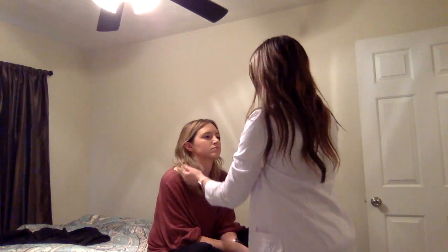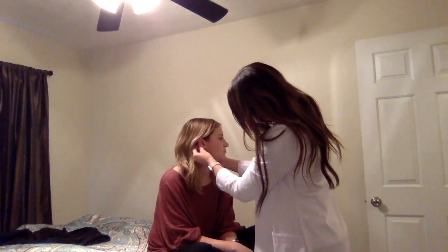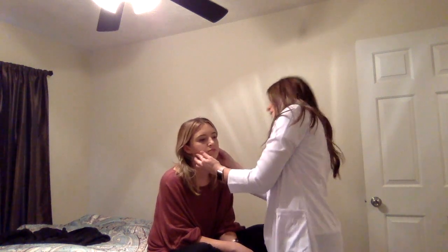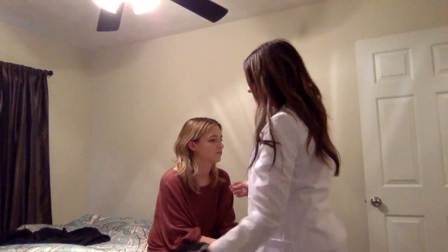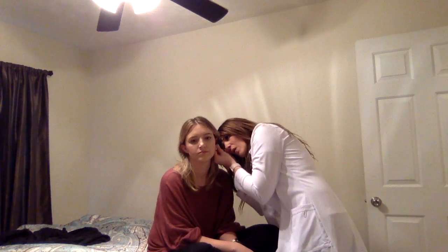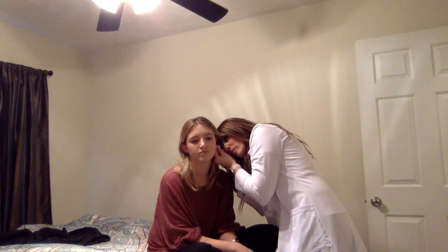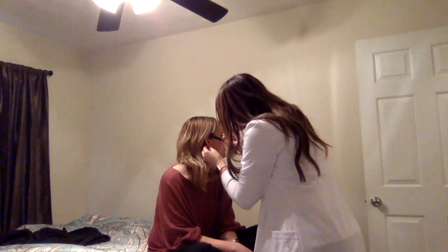And now I'm going to look at her ears. I'm going to look for symmetry. I'm going to make sure there's no bleeding. I'm going to look on each ear and I'm going to palpate the auricle. Okay. And then I'm going to take a look inside at the tympanic membrane in the ear canal. And I see a pearly white gray membrane. I see a light reflex on there. There we go. And this one as well. Same thing in that ear as well.